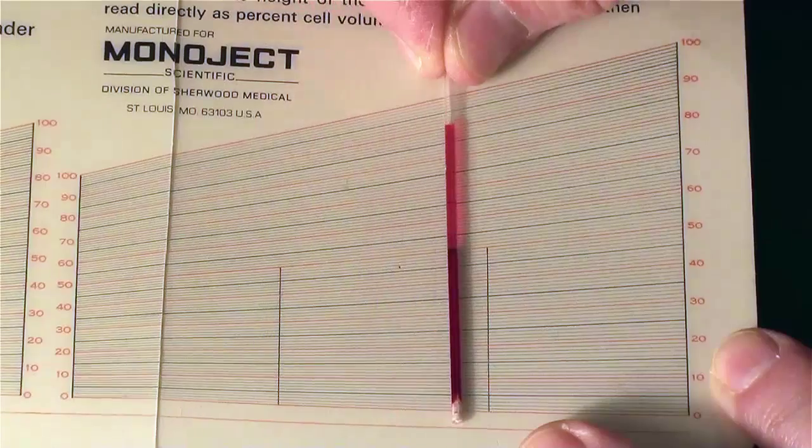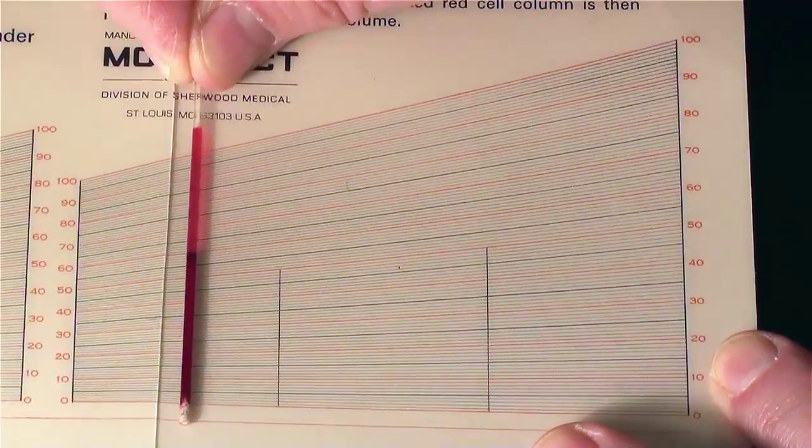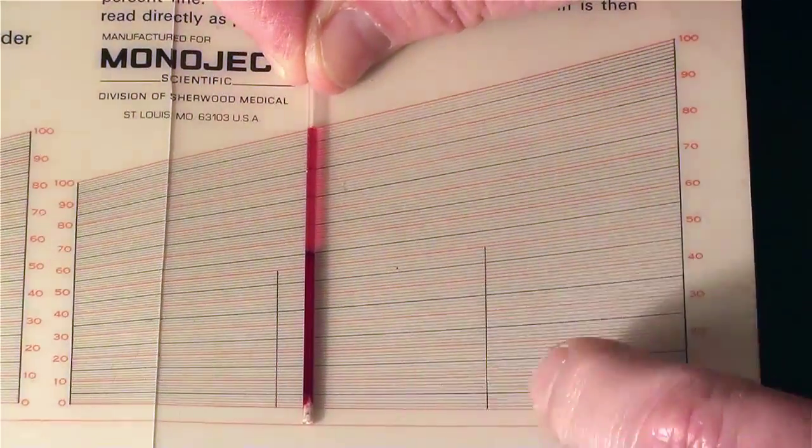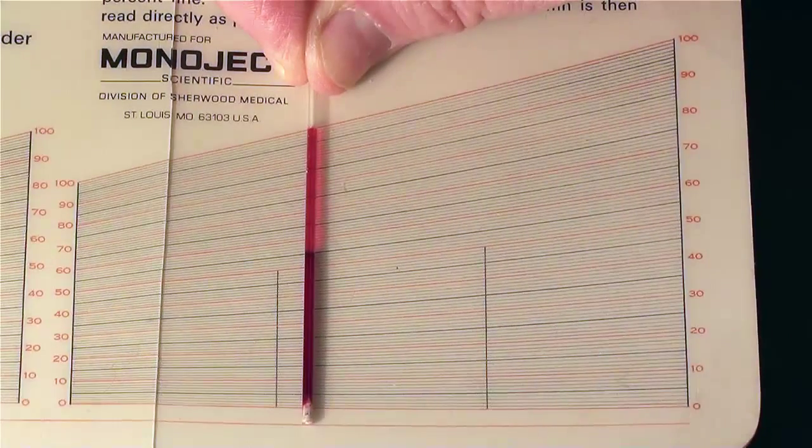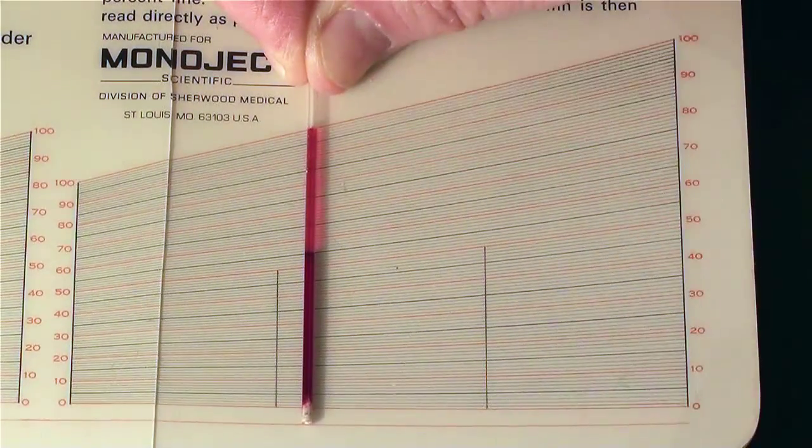In order to do that, I need to slide the tube left and right until the bottom of the blood is on the zero line and the top of the blood is on the hundred line.